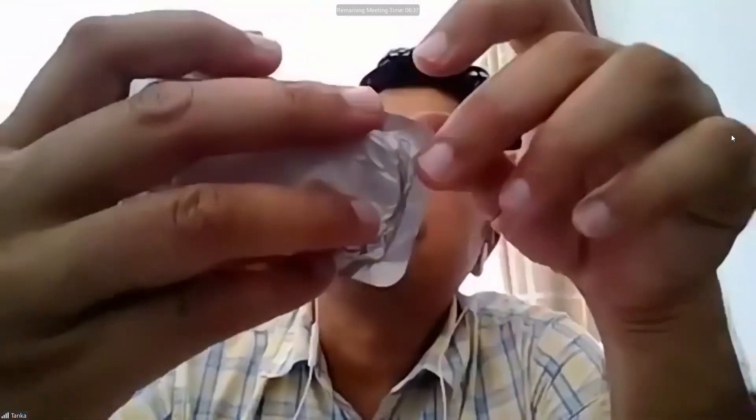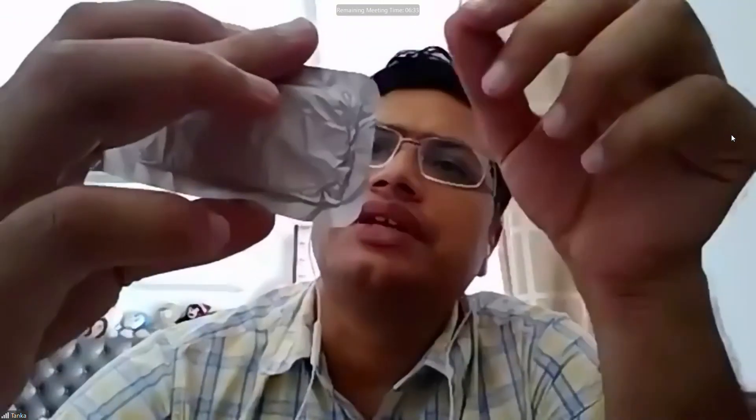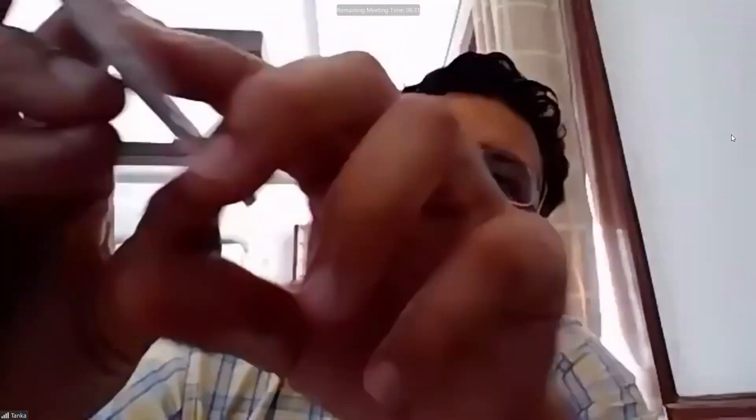If we look in detail at the packet, it is written that it is braided, coated, and the material is polygalactin 910, violet. So every piece of information we discussed in class is written on each suture packet. This other one is a silk suture, size 2-0, non-absorbable, braided, and everything we need to know is written on the packet. They are sterilized — usually by gamma radiation in the factory.